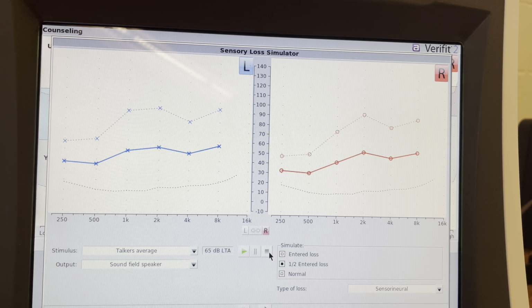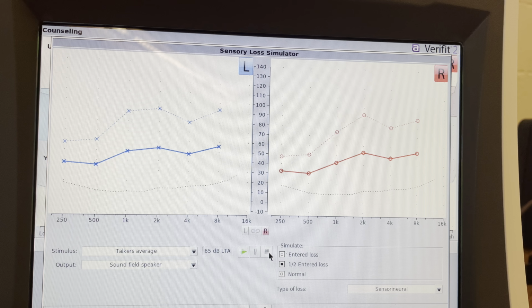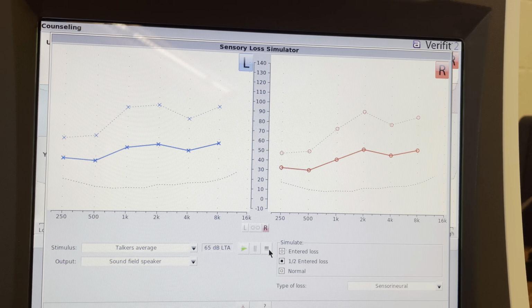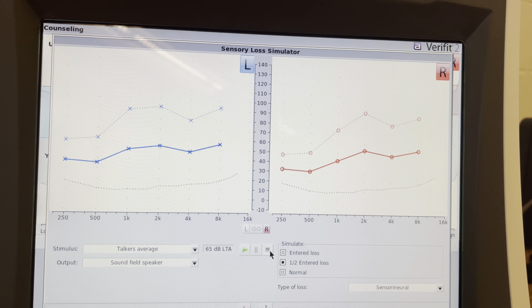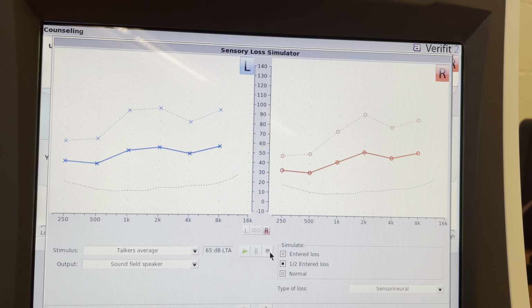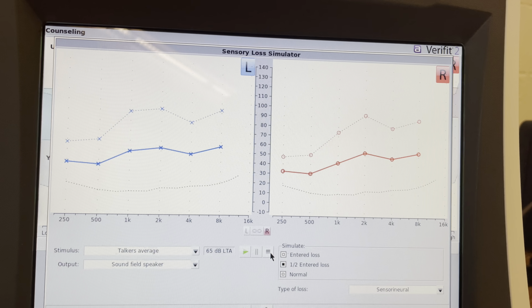So that makes it even harder for students to understand the topic of conversation and everything. So also, this is exactly why hearing aids were recommended, of course, to help her hear better. She also has the remote microphone to use at school that will help her hear her teachers better. And I hope she'll use that more because I think it will really help.